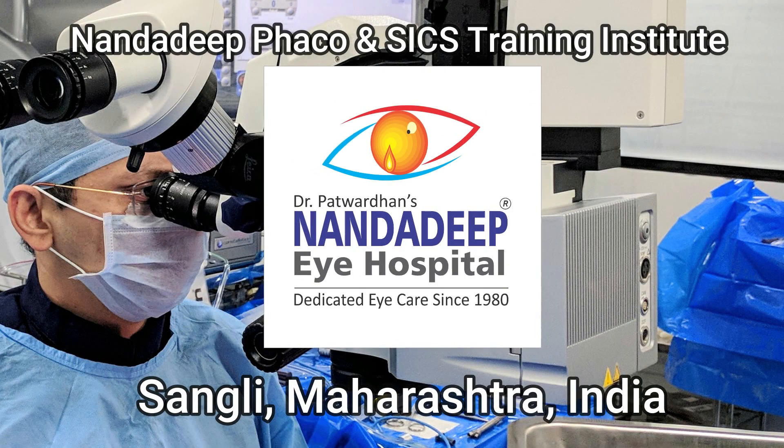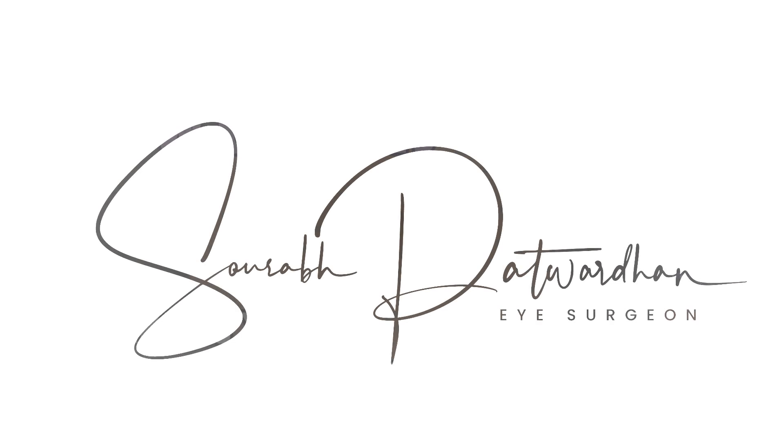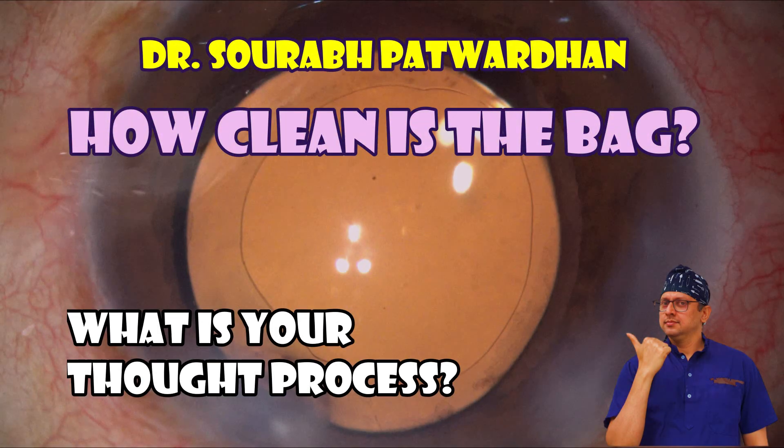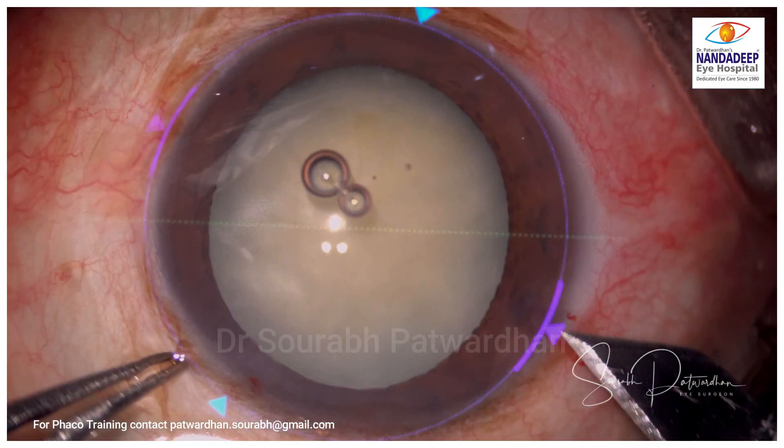Hello friends, I am Dr. Sourabh Patwardhan from Nandadeep Eye Hospital Phaco Training Center, Sangli, Maharashtra, India. In this video I want you to see the cleaning of the bag, how clean the bag is, and I also want to know your thought process.